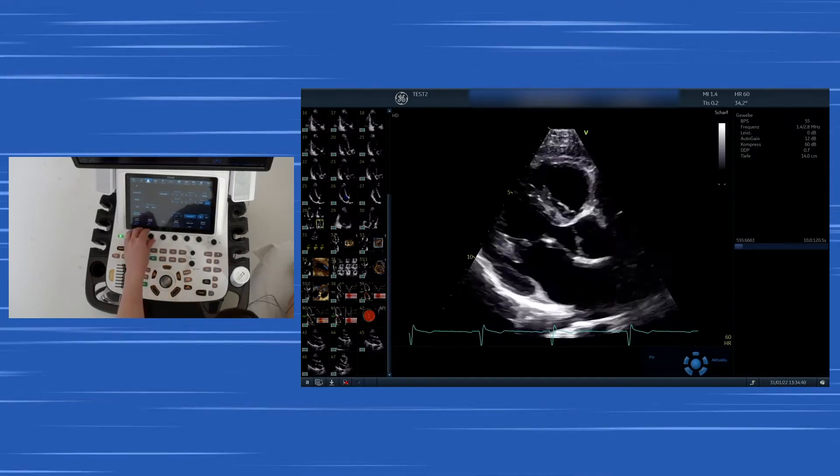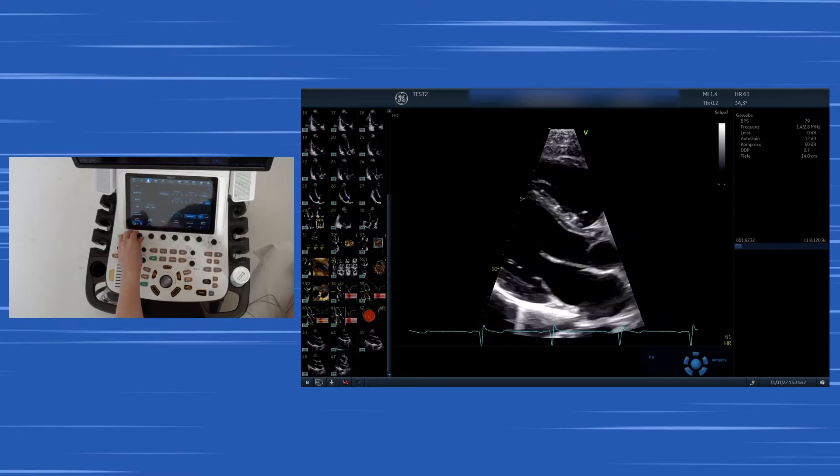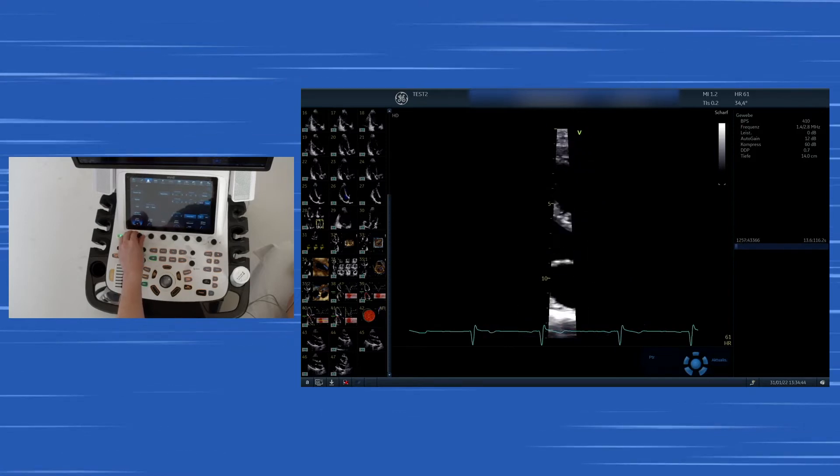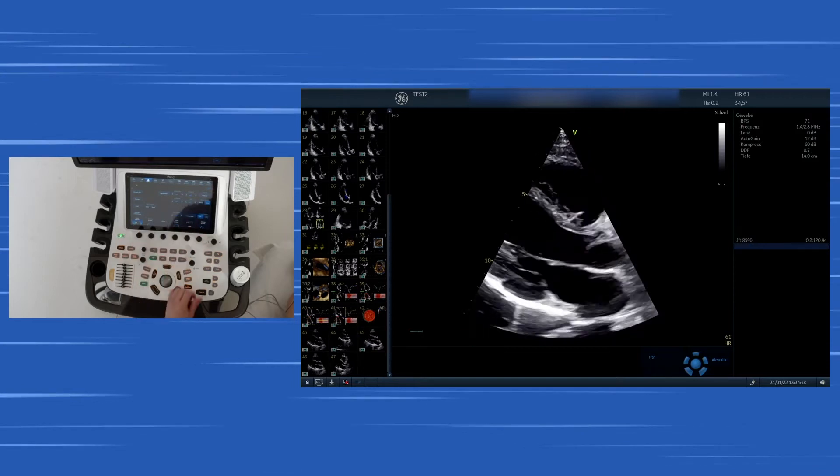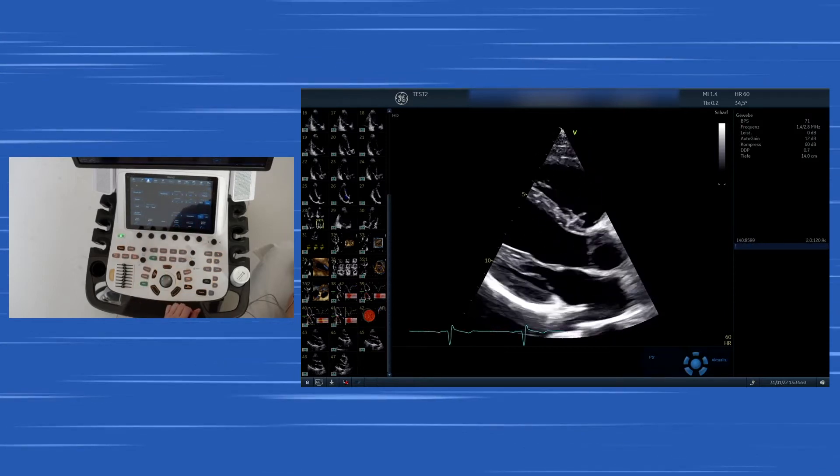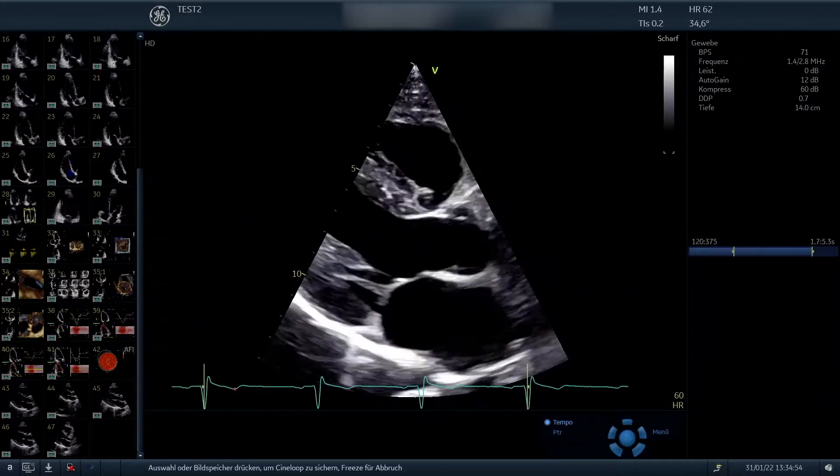As seen in this example you can make the sector very narrow which results in a very good frame rate, but it's not always optimal, so you should have the sector so that you see the entire anatomy you want to see.